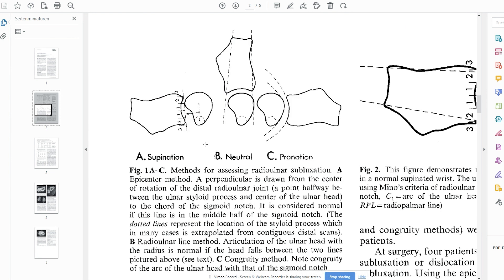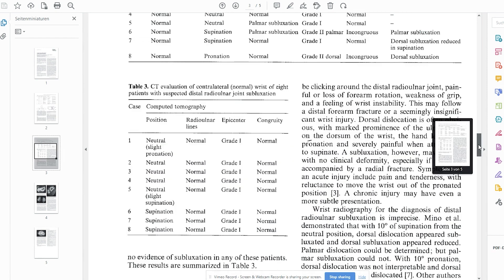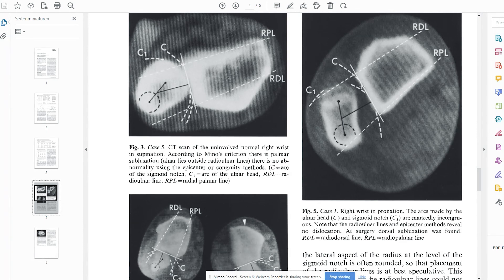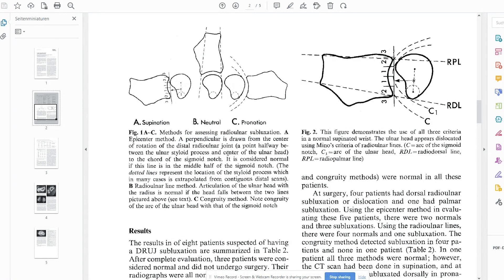It gets even trickier: if you take the time to go to the original reference and read the article, the text on the epicenter method states 'a perpendicular line is drawn from the center of rotation of the distal radio-ulnar joint, a point halfway between the ulnar styloid process and the center of the ulnar head.' They even describe it incorrectly in the text. But going back to the images, the line is not perpendicular to the connecting line — it's perpendicular to the sigmoid notch line. There is a mismatch within this one article, but I would rely more on the images.